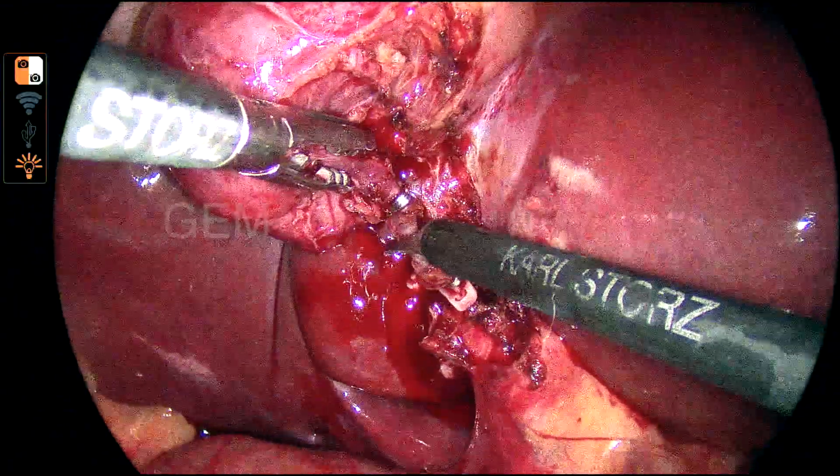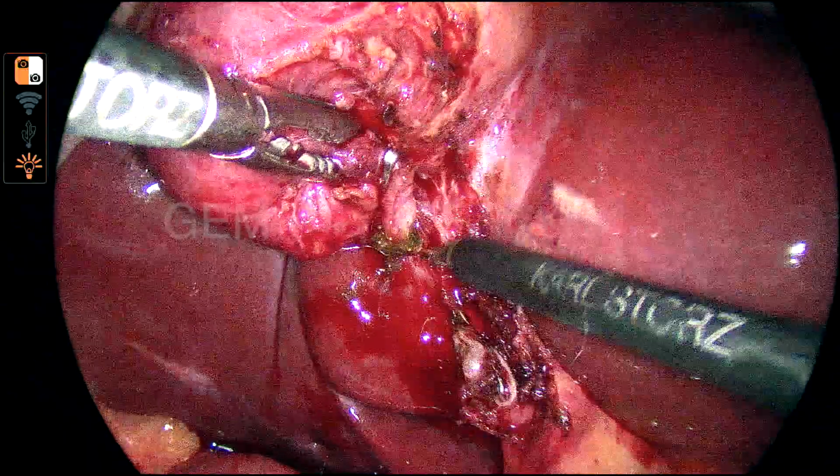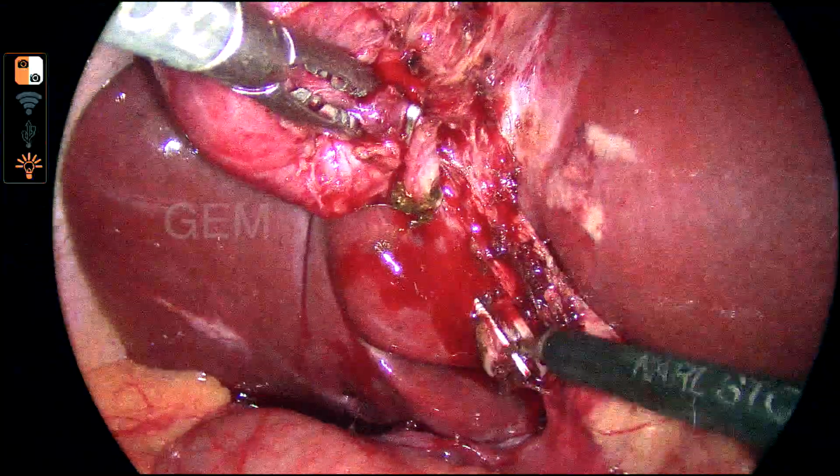You can see after milking out, a small stone is coming out, and debris. So that's why the milking out is very important. I used to do it multiple times before applying the clip to the cystic duct.